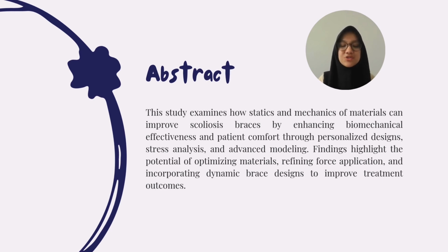We looked at stress distribution, identified key load-bearing areas, and proposed ways to refine materials and force application. The goal is to create braces that adapt to individual needs, improving outcomes while making them easier to wear. And this research brings us closer to better, more patient-friendly solutions for scoliosis treatment.